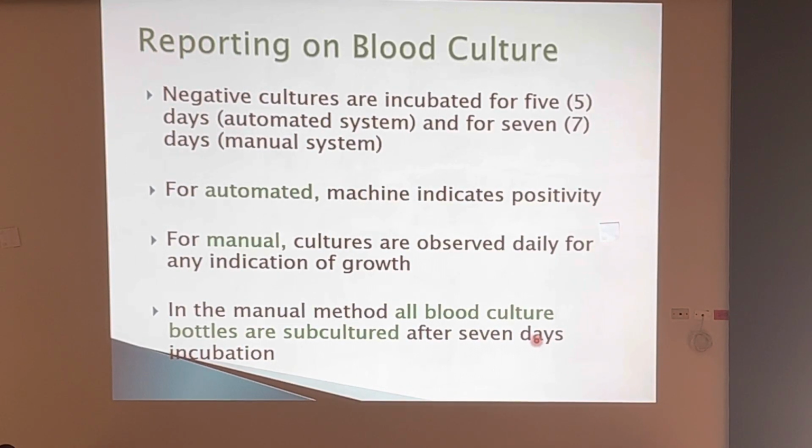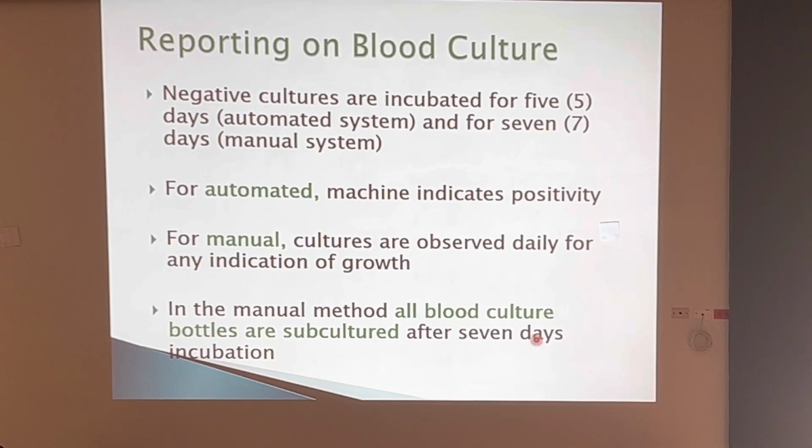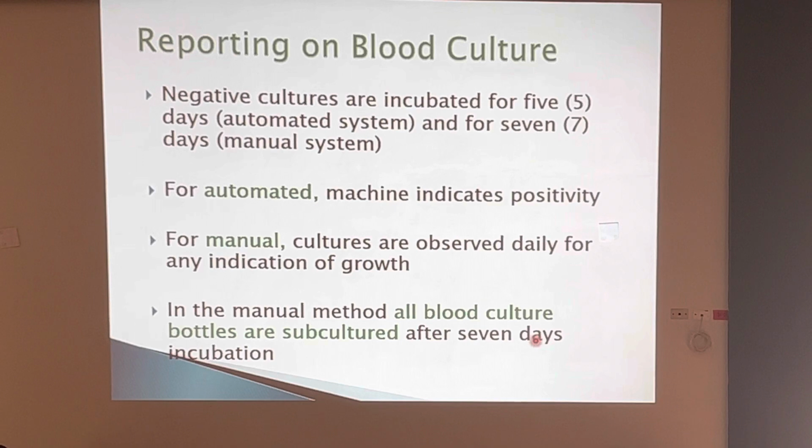And so the technologists will see that message there, pull that bottle. It's been 5 days, send a preliminary report, send a final report at this time, pardon me, and then send a final report to either the ward or wherever it is that the patient came from to say that this culture is negative after 5 days or no growth after 5 days.